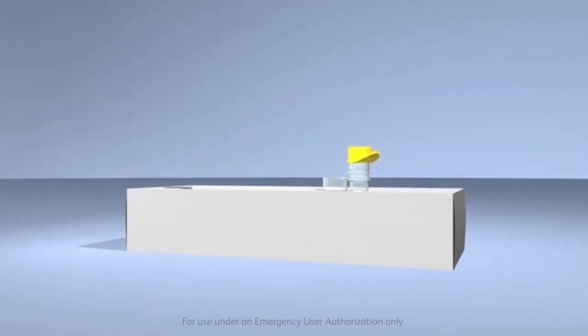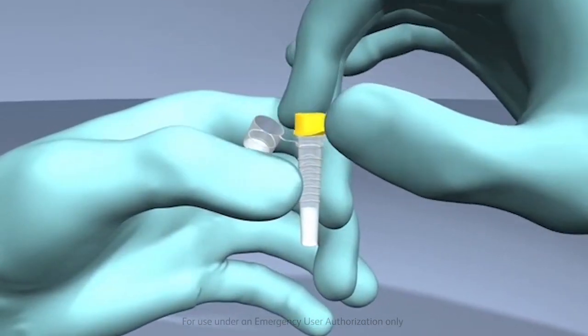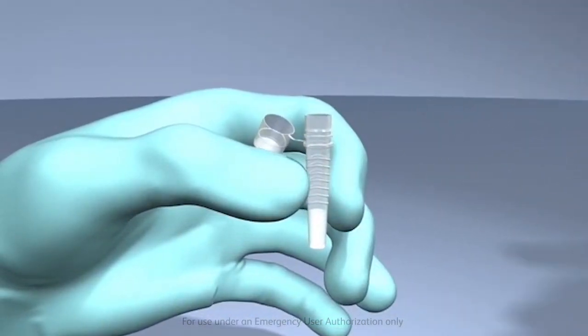After obtaining the proper nasal swab specimen, securely hold the tube in one hand while twisting and pulling straight up with the other hand to remove the cap.